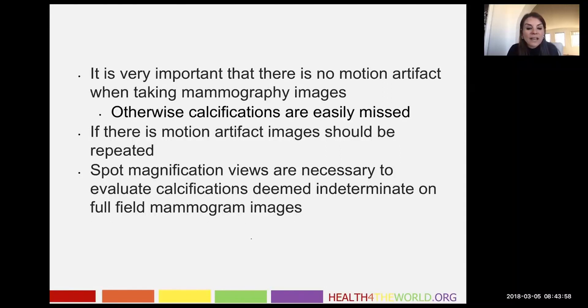Another thing I would want to point out is that spot magnification views are necessary to evaluate calcifications deemed indeterminate on full field mammogram images. The spot magnification views are very important because they truly give us an idea of one, how many calcifications there are, and two, the true shape.